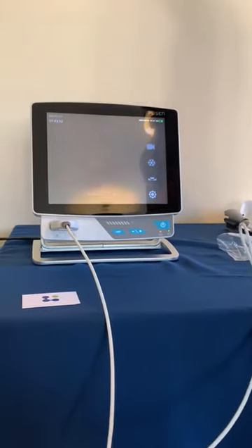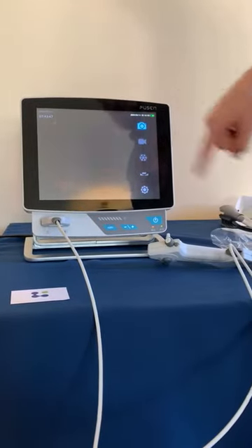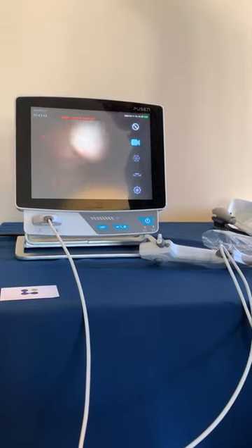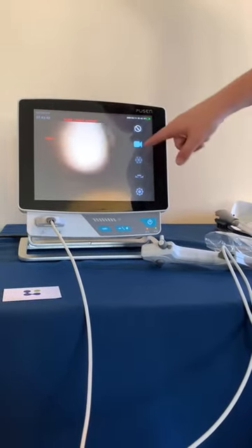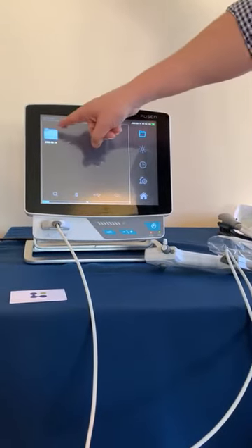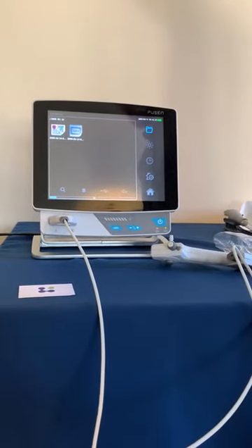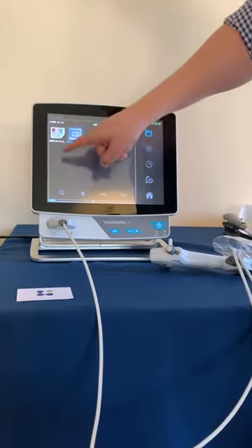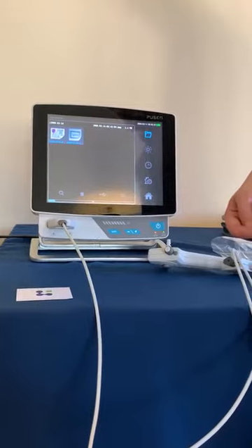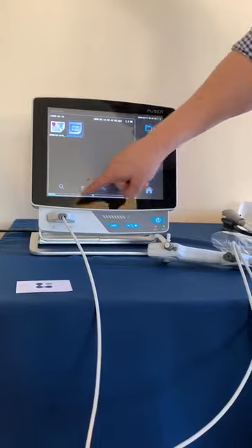So if I'm taking an image that I would like to keep, I can simply press that button and it saves it. If I want to record, I can press that and it's now recording video — press that again and it's saved. Press the bottom settings button and you can see a file saved with today's date will have those images and videos saved to it. We can highlight either one or both and export to a USB, which connects to the back of the monitor. Or if you want to delete any of them, we can delete them also.